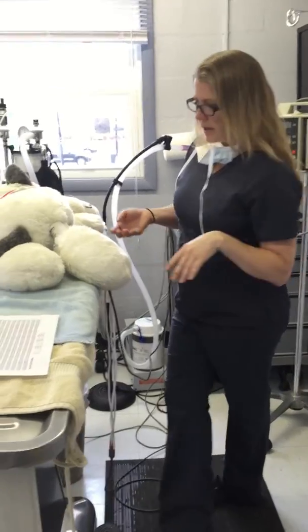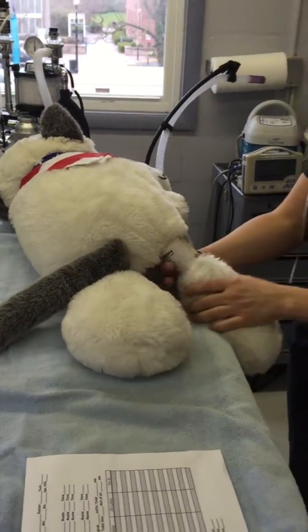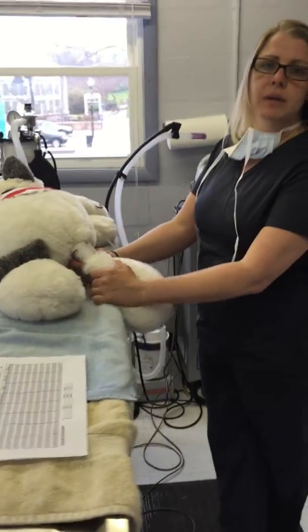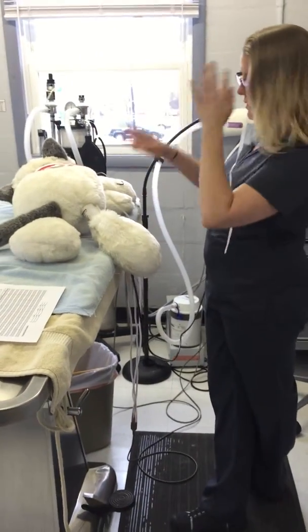The next one that we want to look at is going to be our blood pressure. So I've attached our blood pressure cuff. This guy needed a size 5. I put it on the back leg. I find that the back leg is a pretty convenient place for the blood pressure cuff. Usually in the front legs we have catheters going in and just a lot of other things going on up front.